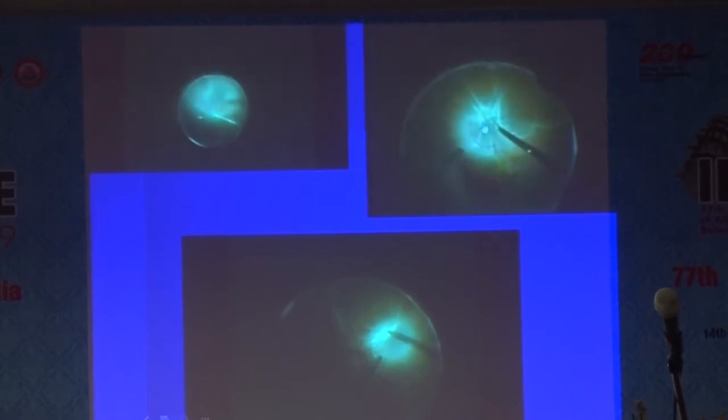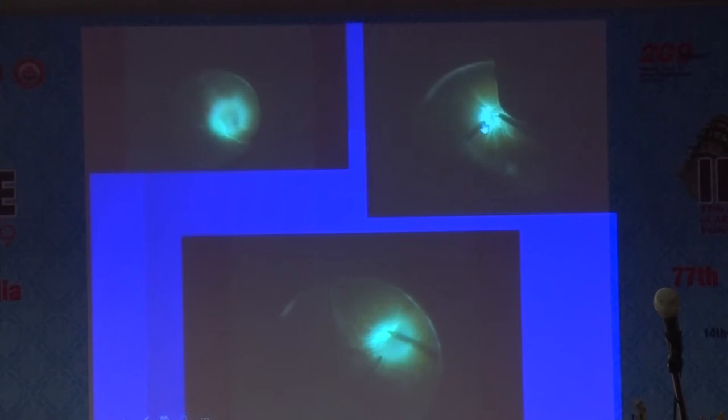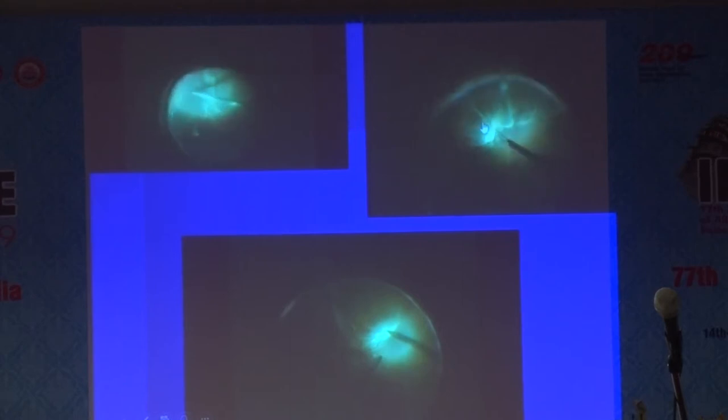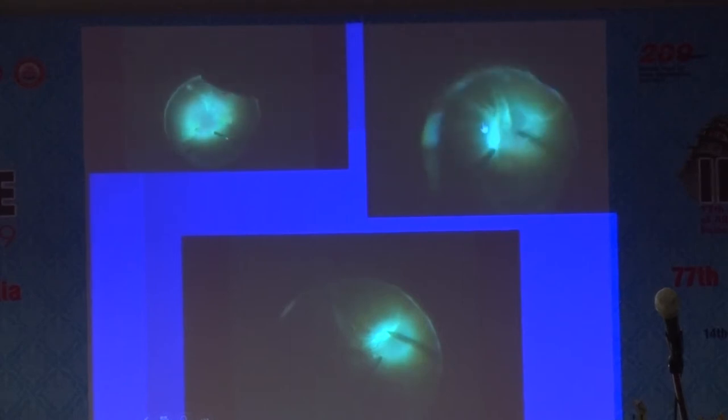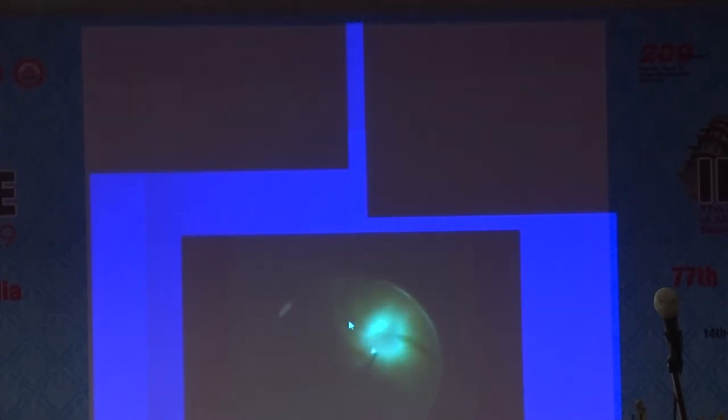Now you have these folds here. Once you have done the vitrectomy, as shown here in the corner, and you have tried to remove that posterior hyaloid, that's very important. But posteriorly, once you have removed it, you see those fixed folds there. So you need to get rid of these fixed folds. Once you remove and release these fixed folds and have nicely taken care of that, you will get something like what you have down there. You see the last bit of a fold.